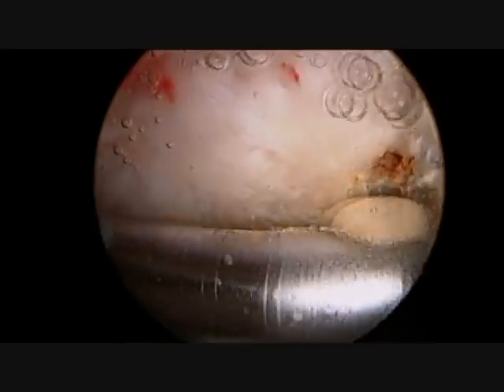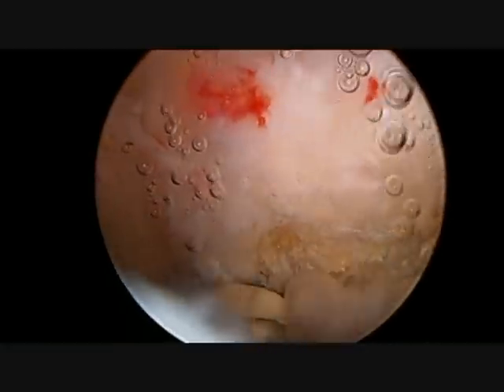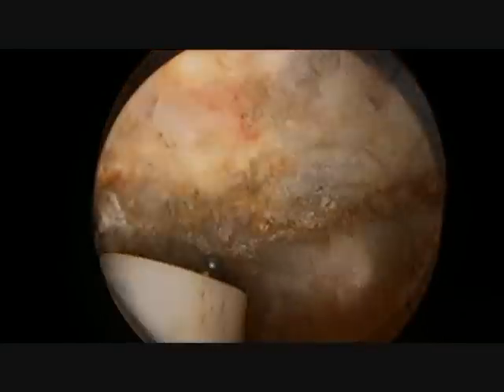Once the shaver has completely removed all of the bursal tissue and adequate visualization has been obtained, the spur can be identified and a wand which is able to vaporize tissue is used to fully expose the bone spur.